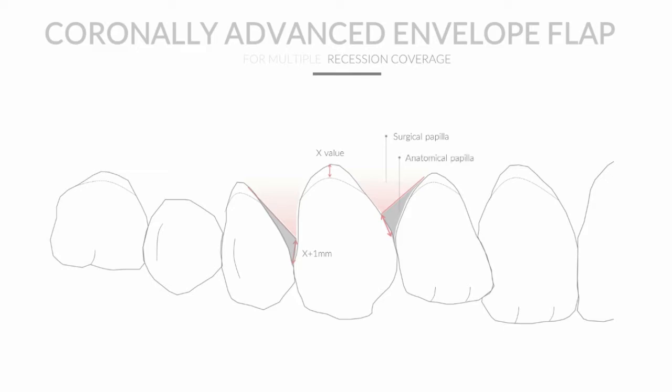We then proceed to the lateral incisor and transpose the recession value to its mesial papilla margin, which will serve as the endpoint of an incision that will start at the apical margin of tooth number 11. So now we repeat this procedure for the first premolar, this time transposing the recession depth values only to the papilla margin distal to the respective tooth. The second premolar is, however, subject of discussion, since no recession can be seen on this tooth.